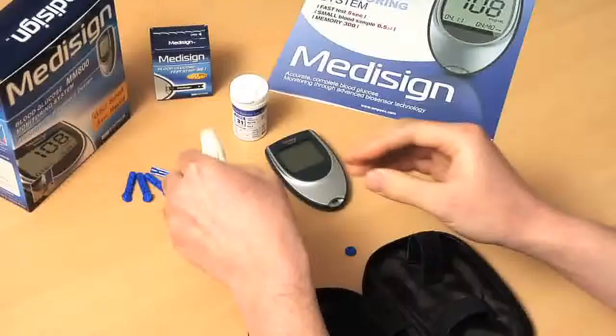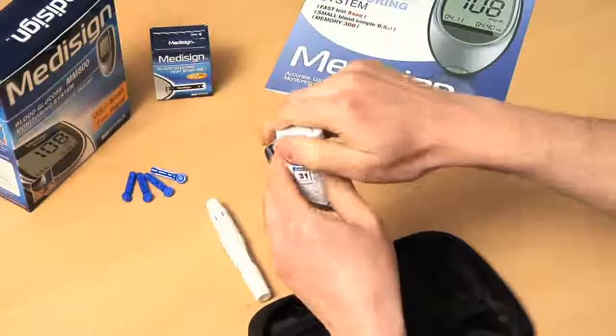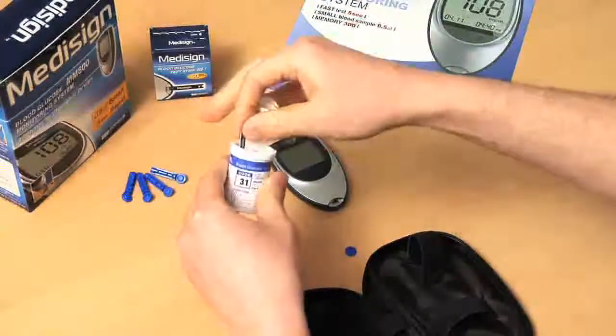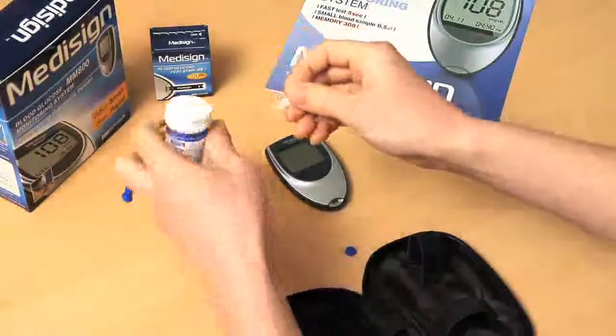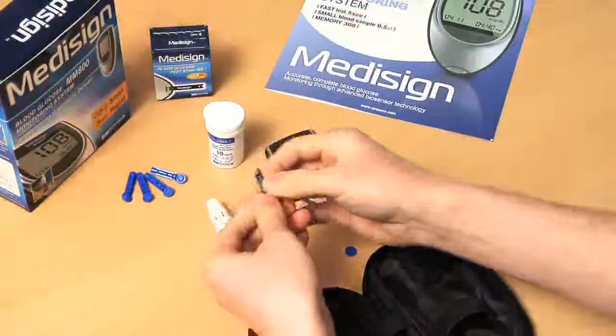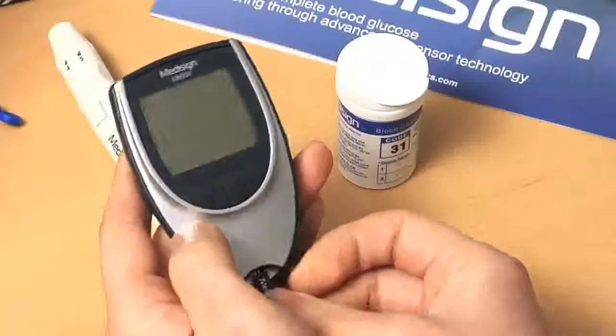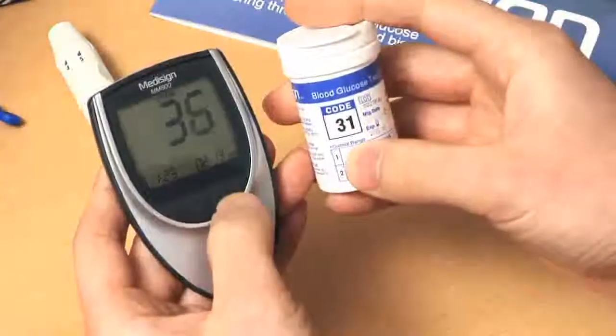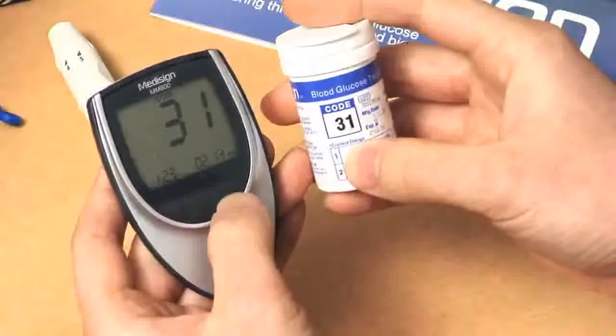Pull out the sliding barrel. Open the lid and remove a test strip. Make sure you close the lid immediately after removing the test strips. Insert a test strip and adjust the code. Be sure the meter code matches the code on the test strip vial.